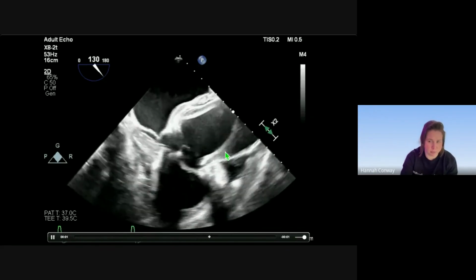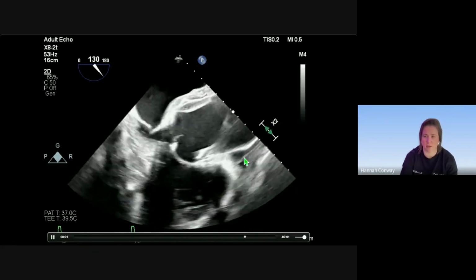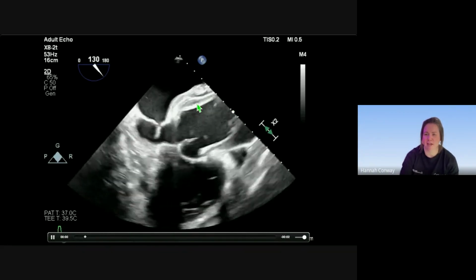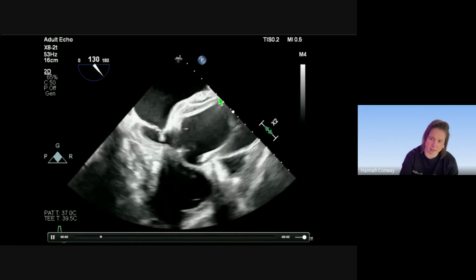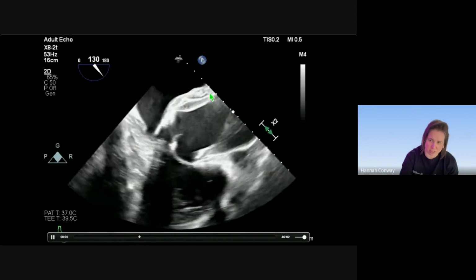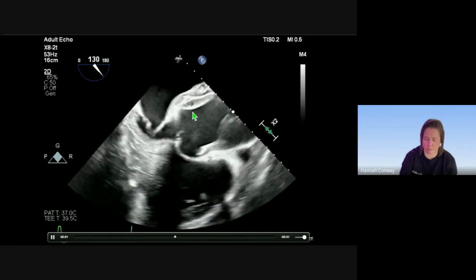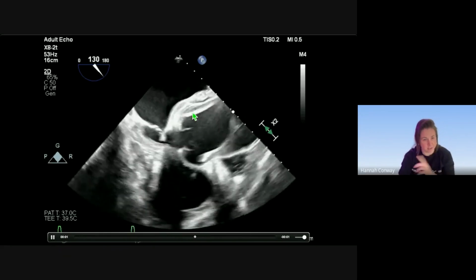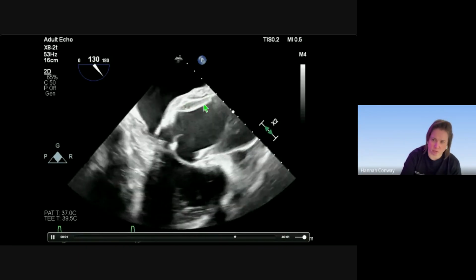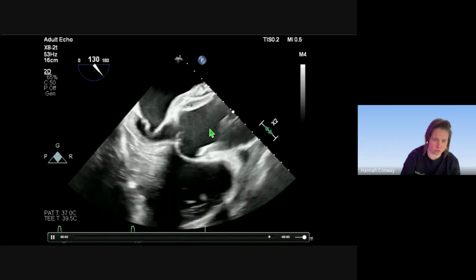And that will explain why we've still got very preserved LV function, which is the only thankful thing that this patient had to be thankful for. The other thing to note here, look, that's quite thick there and irregular. And this actually turned out to be a periaortic thrombus. So this patient had actually bled and dissected quite a way before it presented. And as you can see, we've got sort of intramural bleeding there. And we've got our false lumen here and our true lumen here.